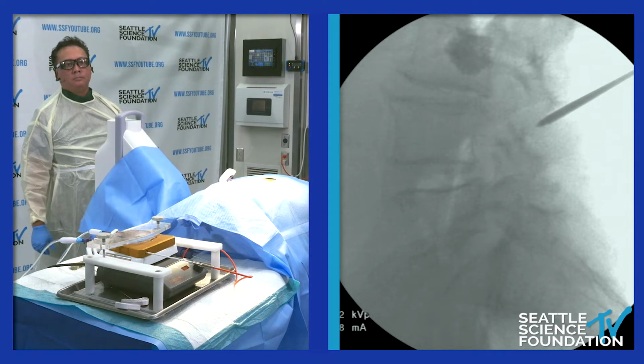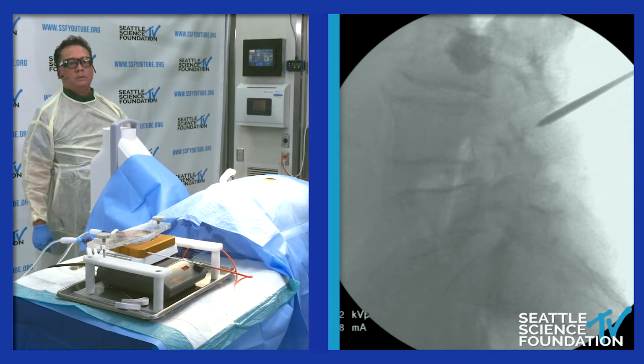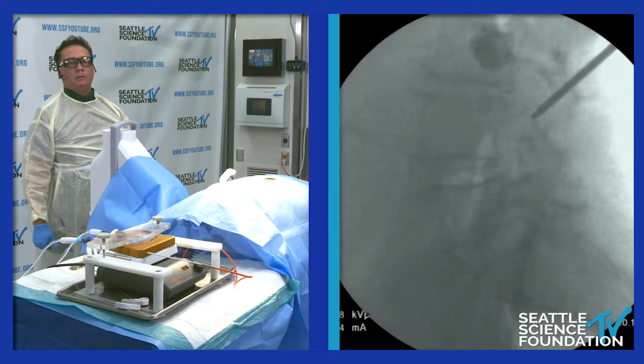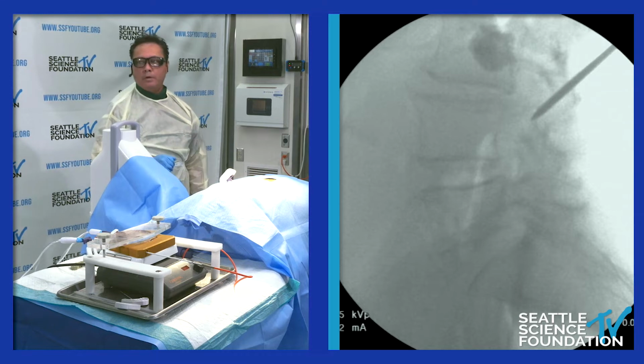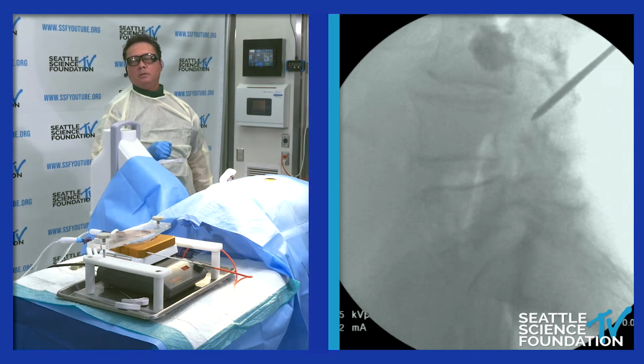What? Yev, did you see that? Yeah, it's a completely different angle than we usually use. I'm still at a very medial position. Let's go back to it.